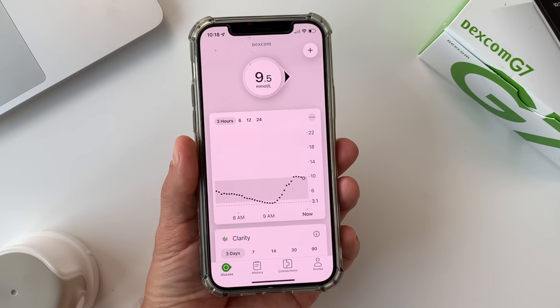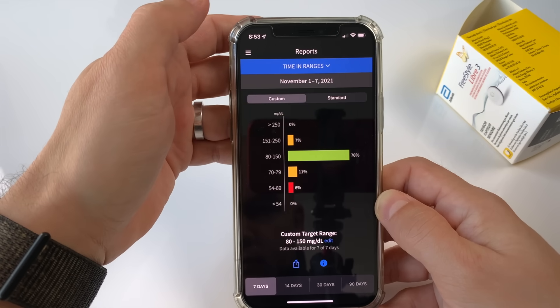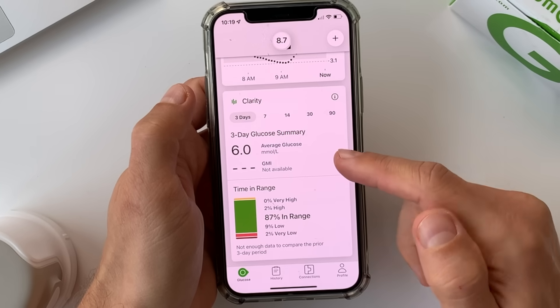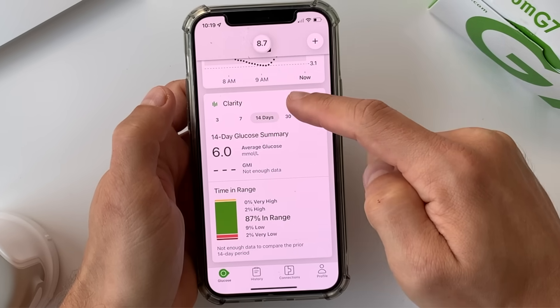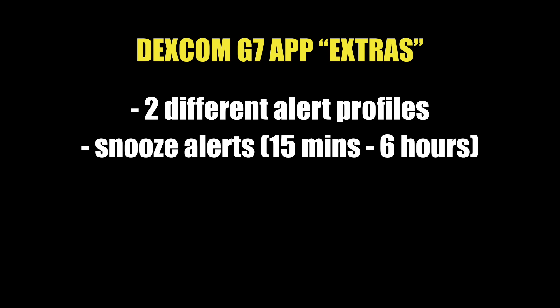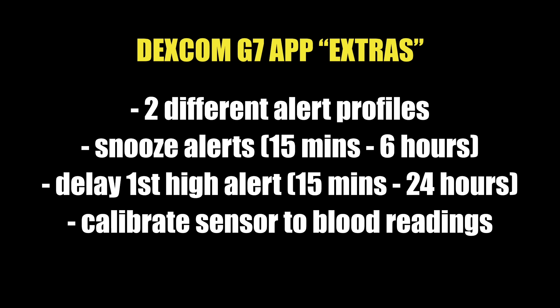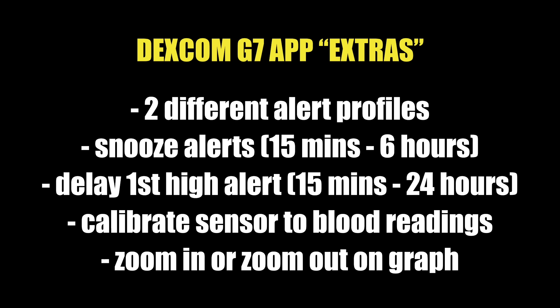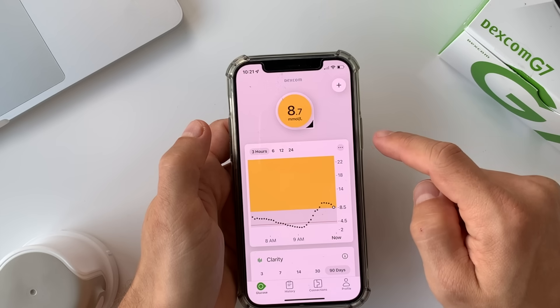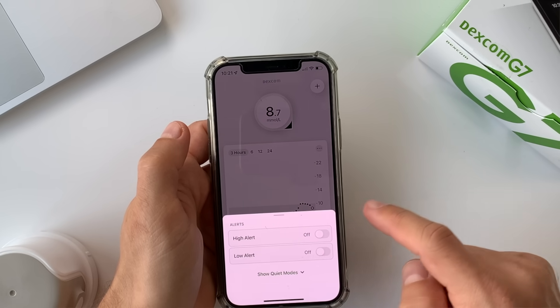Moving on to difference number 6: mobile apps. Both Freestyle Libre 3 and Dexcom G7 apps show you the glucose graph, your glucose number, and glucose trend. They have customizable alarms and offer overviews of historical glucose data. But there is a lot more you can get from the G7 app. With Dexcom G7 you can create two different alert profiles, snooze alarms for 15 minutes up to 6 hours, delay your first high alert by 15 minutes up to a few hours, calibrate sensor readings, and zoom in and out on specific time frames. The G7 app is way more modern and customizable than the old-fashioned, medical-looking Freestyle Libre 3 app.